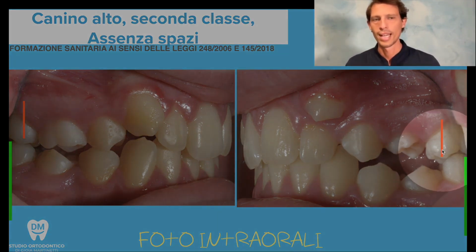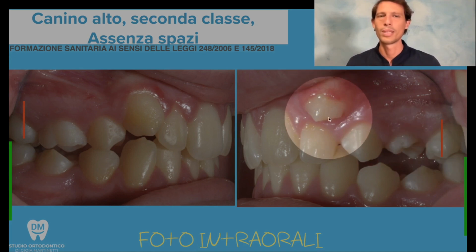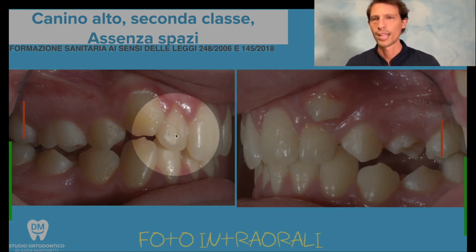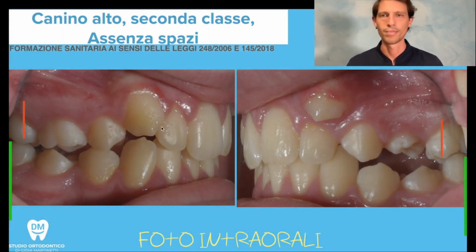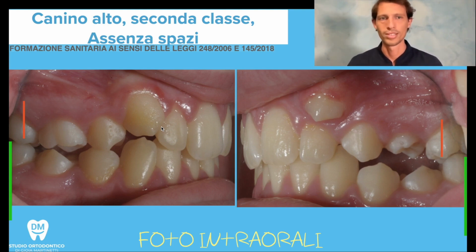But instead, everything being forward causes these teeth, by moving forward, to take up space. They steal space from the canine, which can no longer come out, not on the left, and even on the right, it's not positioned well either. A really difficult situation to correct, which, as we've said, usually can be fixed either with extractions or surgery. But we managed to do everything without these interventions.